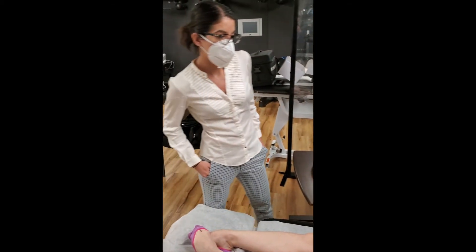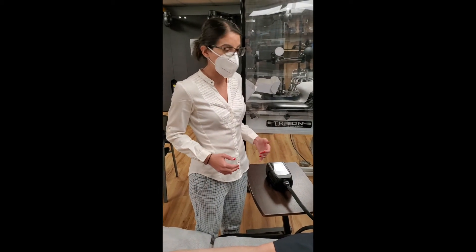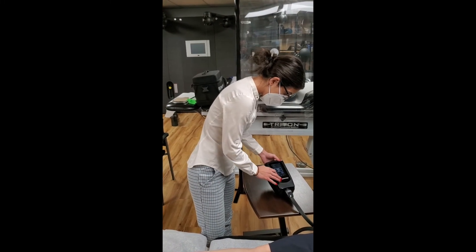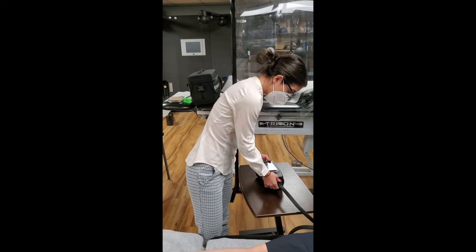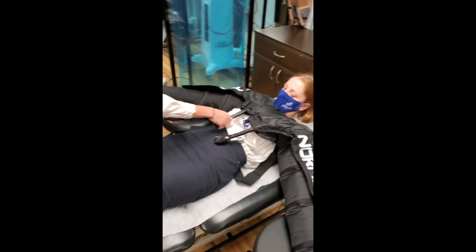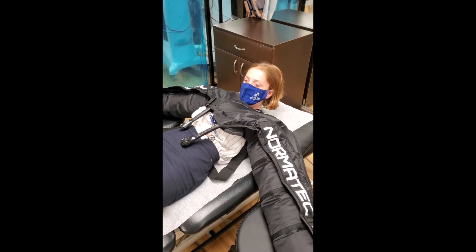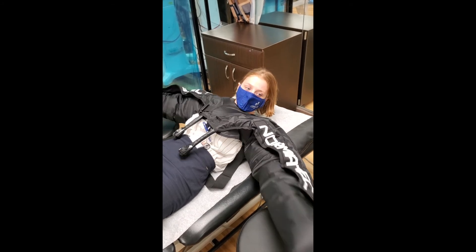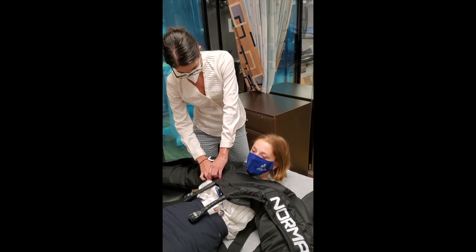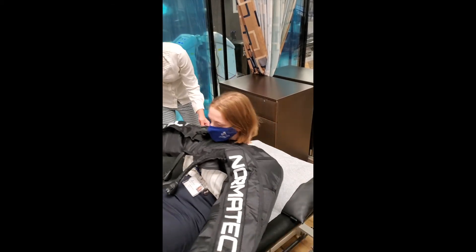You let this run its course for the 10-minute treatment session, and I eventually build that up as I progress patients through their care. When you're done, you quit the session and simply release the patient. If anyone gets anxious or feels slightly claustrophobic, it's very easy to deflate — I can move already and Steph can just unclip me in a matter of seconds, so you can stop the treatment if needed.